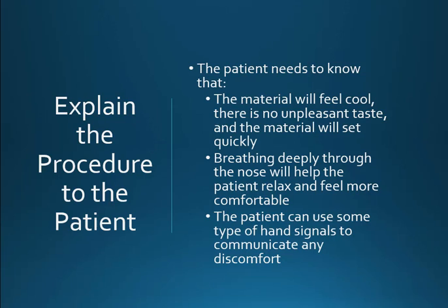Okay, let's talk about explaining the procedure to the patient. So, what does your patient need to know? They need to know that the material is going to feel cool, that there's not going to be an unpleasant taste, and that the material will set up quickly. I usually tell them it'll set up in a couple minutes.